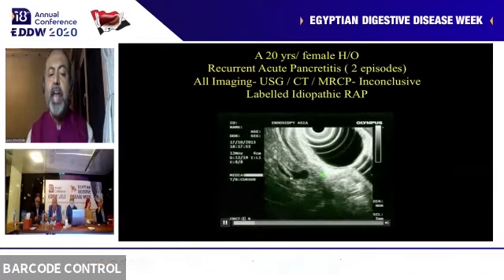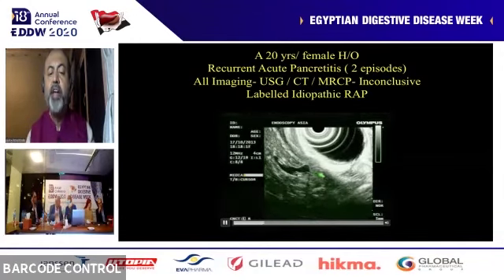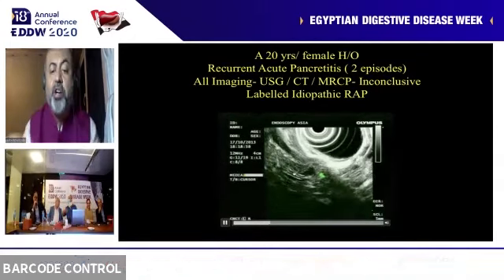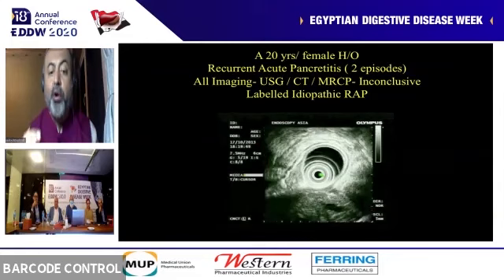There was a live ascaris refluxed completely into the pancreatic duct here. You can see the gut of the ascaris. You can see that like a stent. It's a stent-like structure in the pancreatic duct. So this is the power of endosonography mapping of the pancreas and the pancreatic duct.